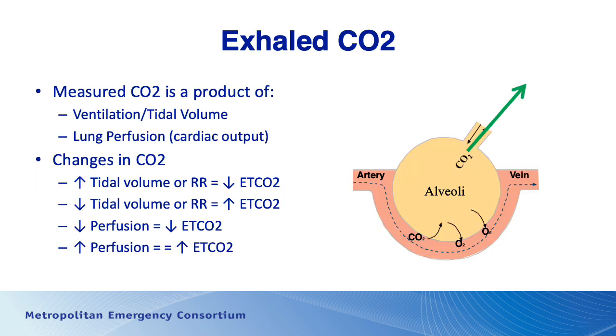But before we do that, just want to quickly go over a couple-minute review of capnography and what it's about. So capnography is about measuring exhaled carbon dioxide, and the amount of carbon dioxide that's in the air being measured is really a product of ventilation, meaning how much air we're able to move in and out of the lungs and how fast we're moving air in and out of the lungs, and a measure of lung perfusion by blood.